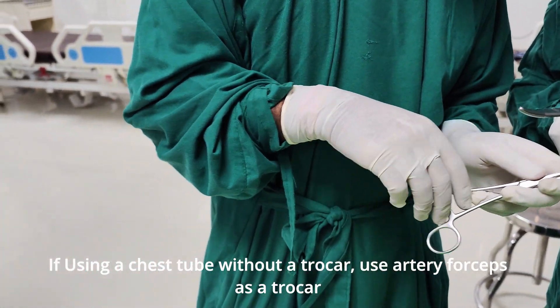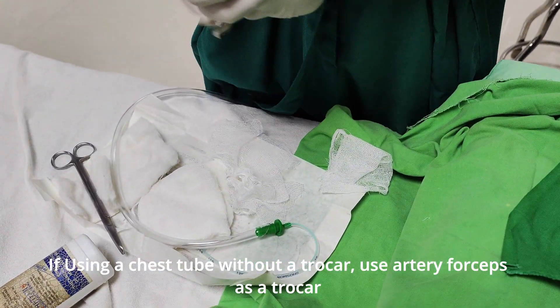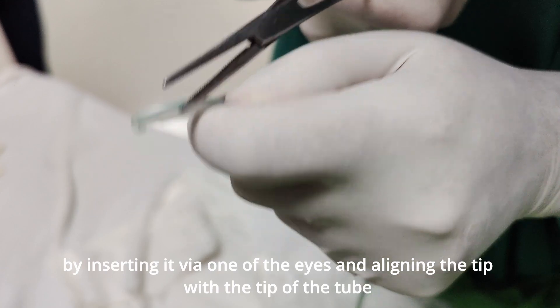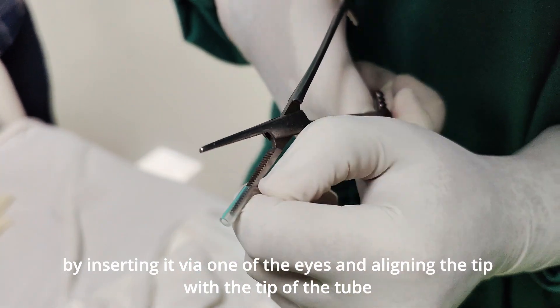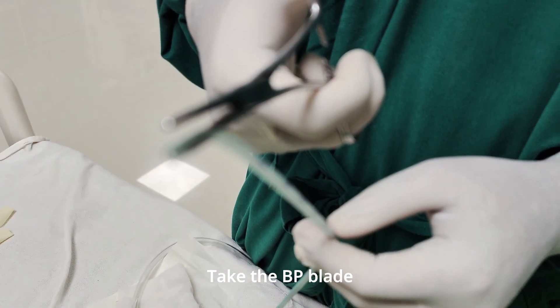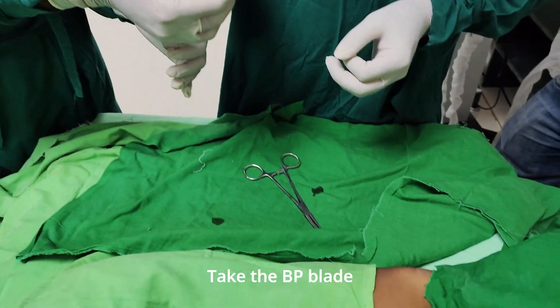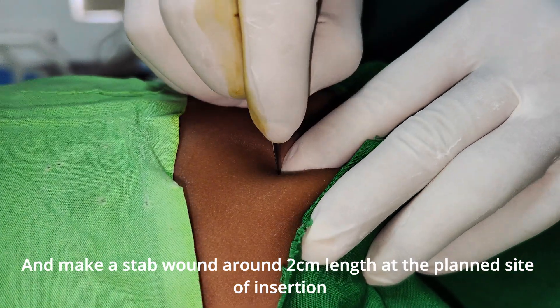If using a chest tube without a trocar, use artery forceps as a trocar by inserting it via one of the eyes and aligning the tip with the tip of the tube. Take the BP blade and make a stab wound around 2 cm in length at the planned site of insertion.